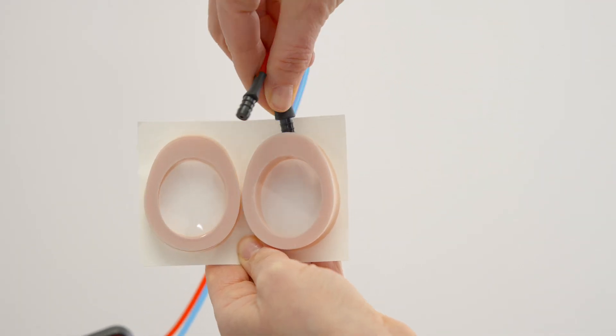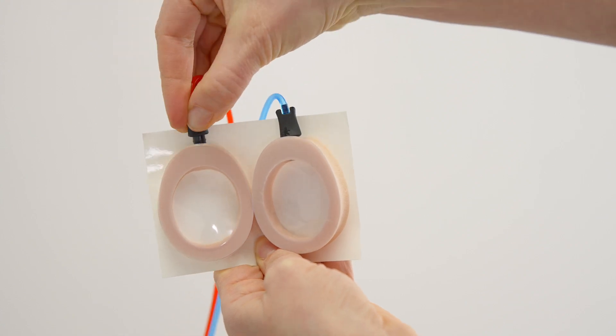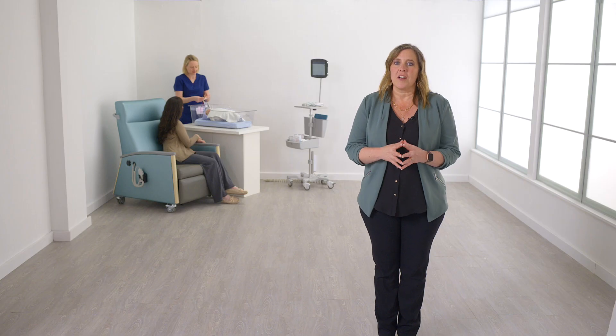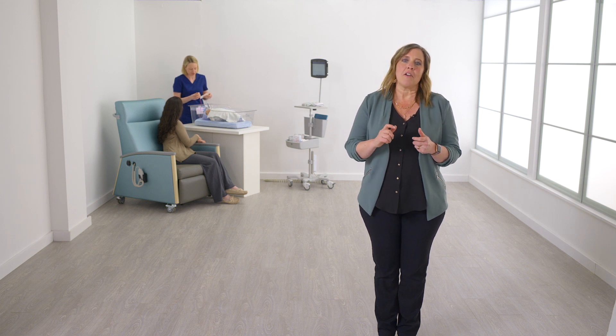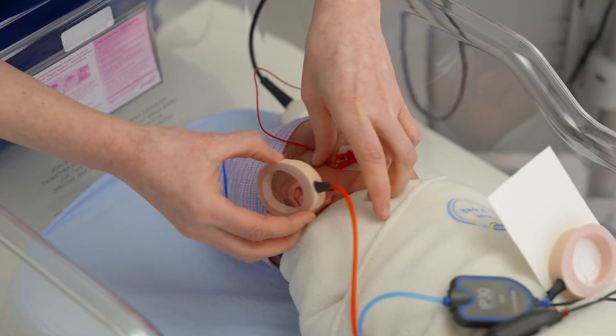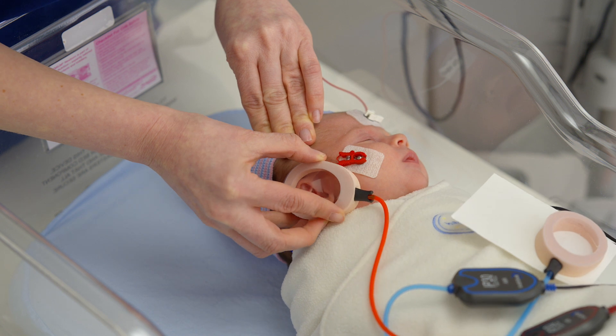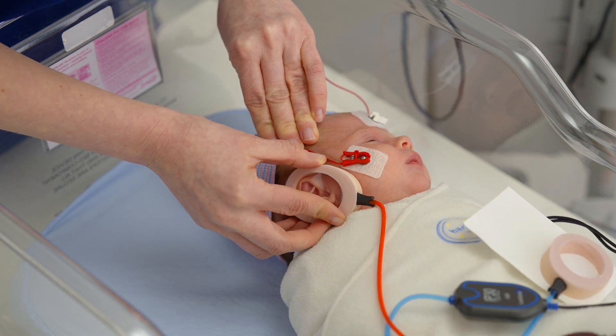When using ear cups, fully insert the black adapter at the end of the red and blue tubing into the opening of the foam. Massage the front of the ear canal and pull down and out on the outer ear to pop the ear canal open. Peel the ear cup attached to the red tubing from the backing card and place it around the baby's right ear. Press around the entire circumference of the ear cup to ensure adhesion to the baby's skin.